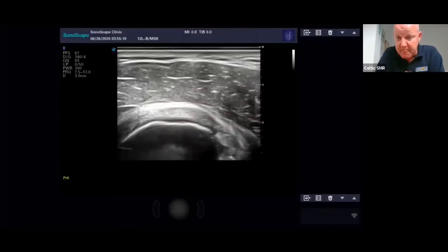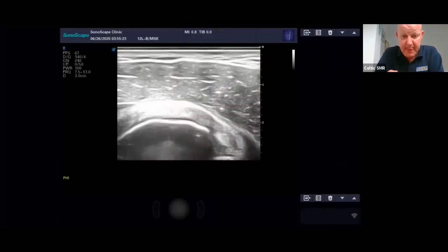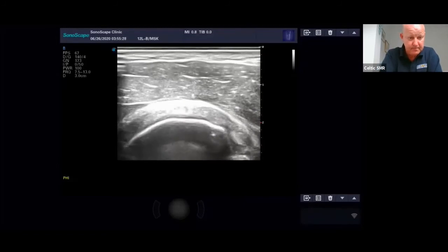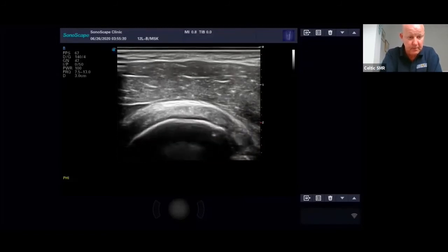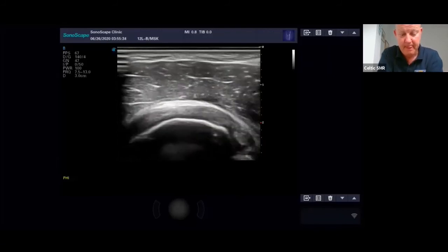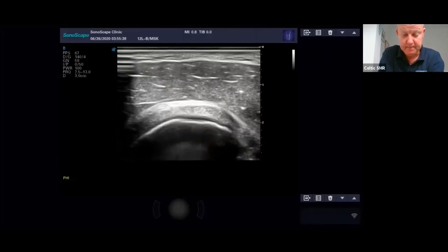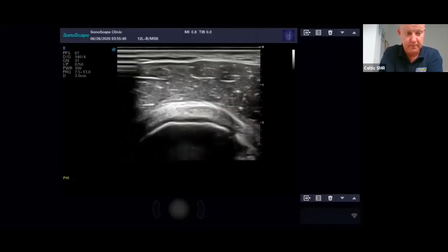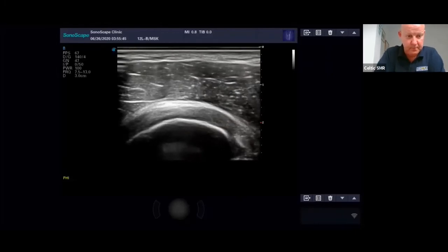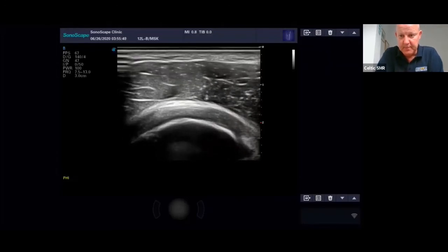Just to mention the gain as well, I didn't go over the gain. So if I'm going to turn the gain right up, and you can see that is very bright now, and I'm going to see very little. So always alter your gain. Your gain's not adding any more ultrasound dose into the patient. It's just simply emphasising the returning echoes. So don't be afraid to change your gain. Get it to what you like, so you can see the borders and things, and just manipulate your gain and things like that.